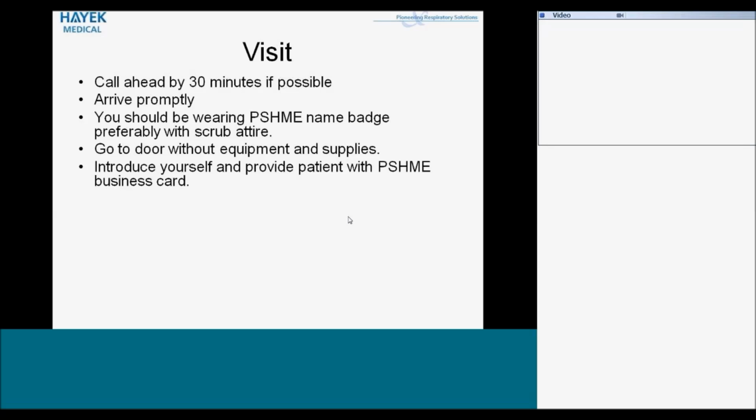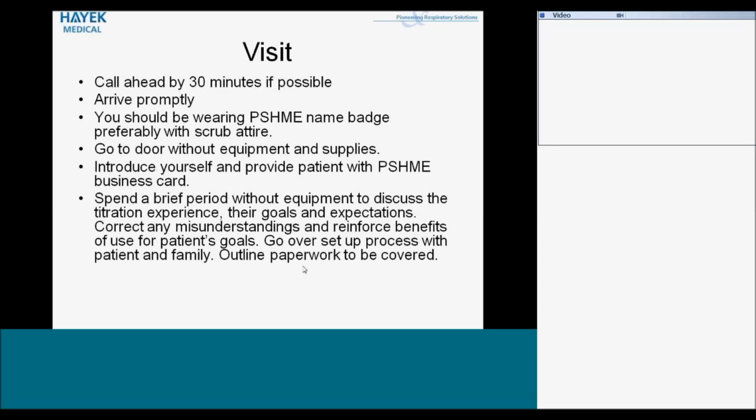So if you don't have any of those, please make a request to Michelle to get a few. Spend a brief period without the equipment to discuss the steps that they went through with the setting selection process, their particular goals and expectations. They may have pie-in-the-sky goals for this, or they may not even understand what the correct goals are. So correct any misunderstandings, reinforce the benefits of use for the patient, go over the setup process and what you're about to do, outline the paperwork that you're going to cover.